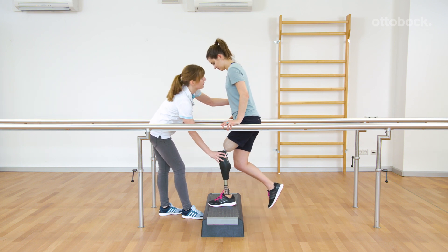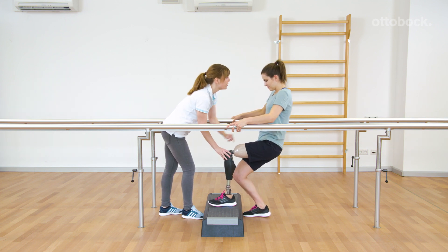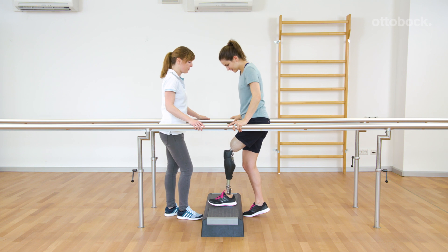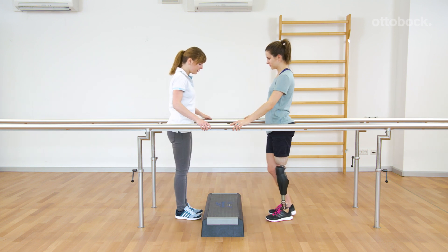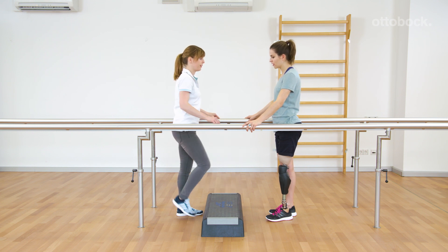In case Rika loses balance and the center of mass moves backwards, the knee joint flexes against the hydraulic stance flexion resistance. If the prosthesis is not loaded after triggering the stair function, the joint won't block in the flexion direction.